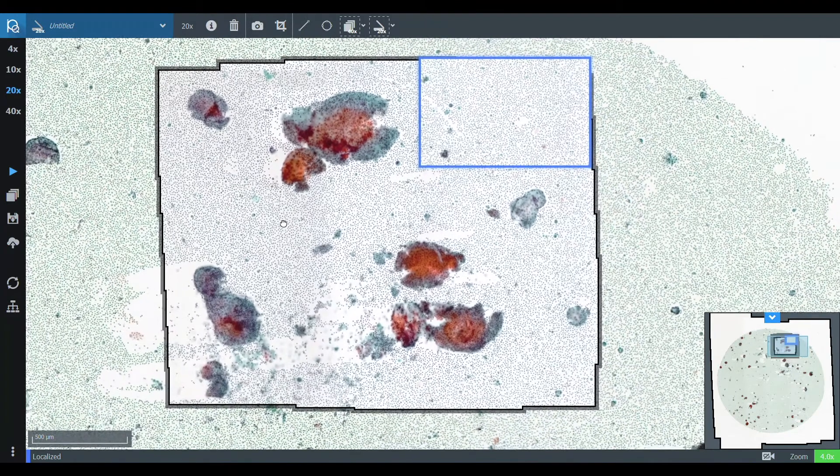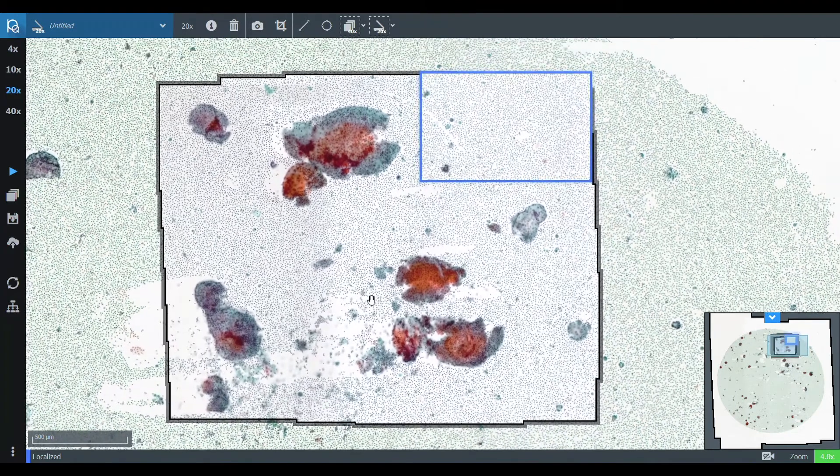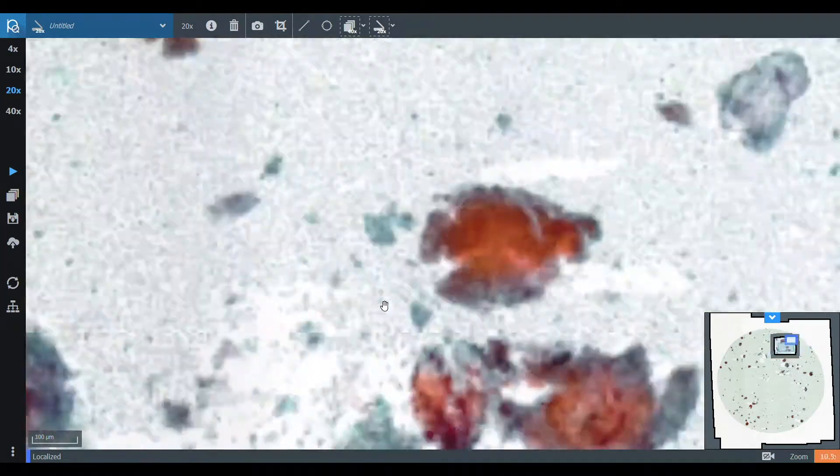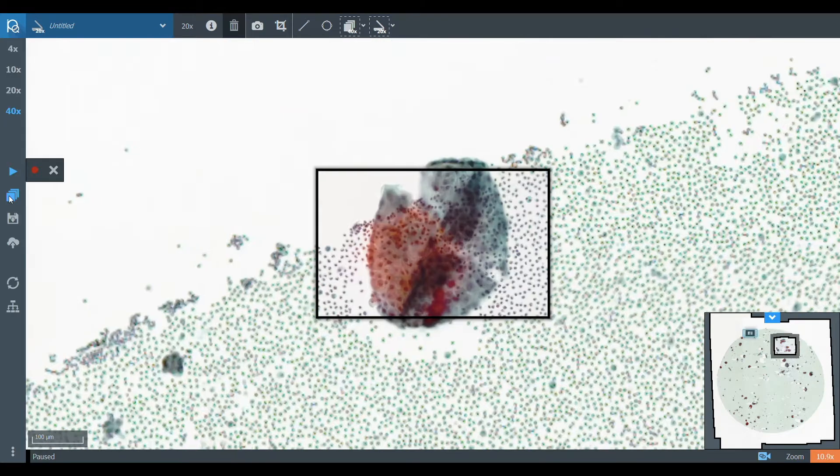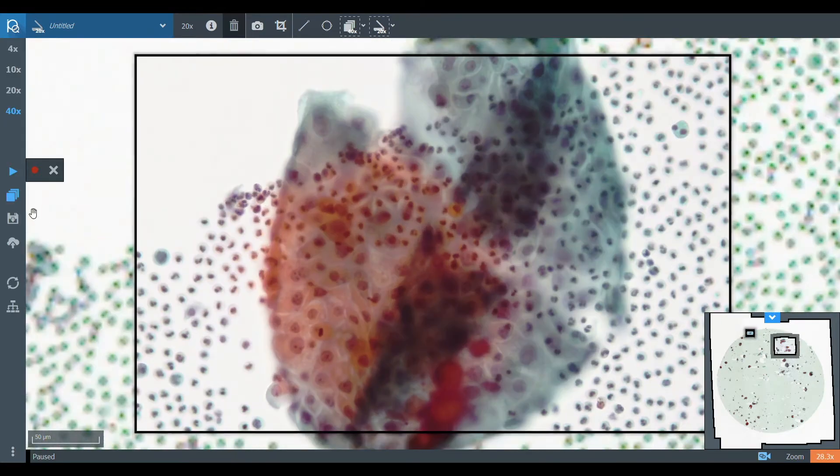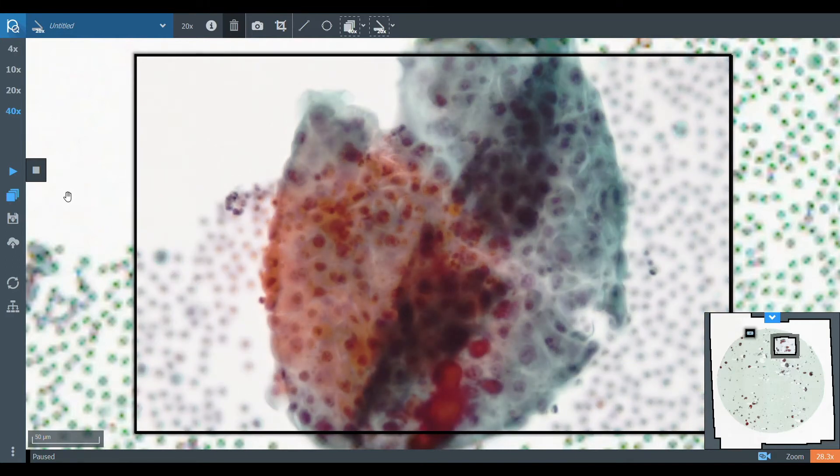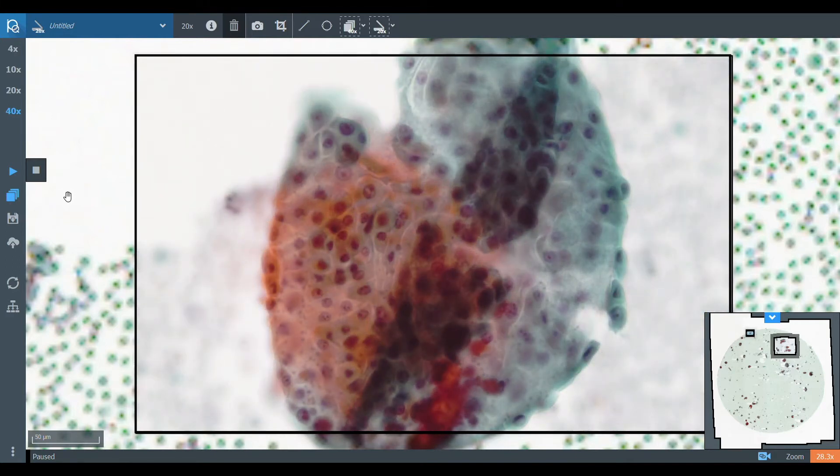Embedded scans are captured seamlessly at up to 100 times magnification. Panoptic's z-stacking technology allows subspecialty fields such as cytopathology to record the three-dimensional complexity of their samples in full detail.